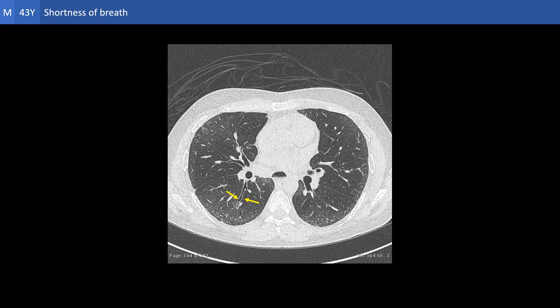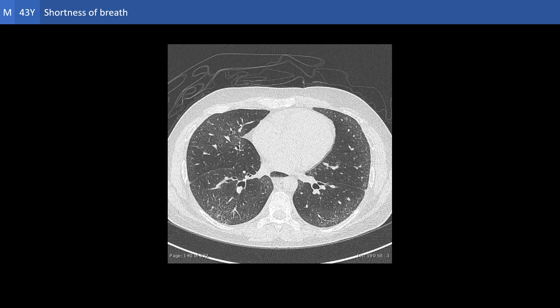This is another site of cylindrical bronchiectasis, evident by wall thickening and failure of tapering of the bronchi.